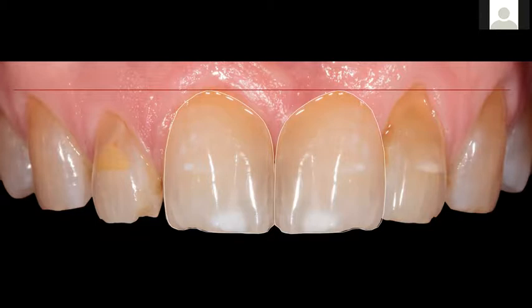So in this case, we found out that, in addition to being able to place the implant, and we'll look at the bony situation here in a second, which was kind of precarious, we also needed some soft tissue grafting to at least cover these root recessions so that we can get better proportions of those final crowns, and then also to go ahead and bulk up that slight concavity there in site number 9 as well, if the bone would be good enough. Otherwise, bone grafting would be needed there as well.